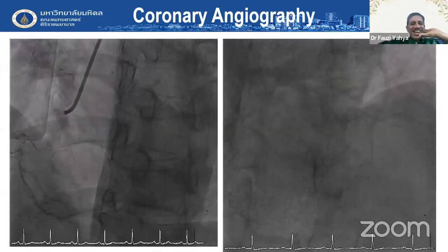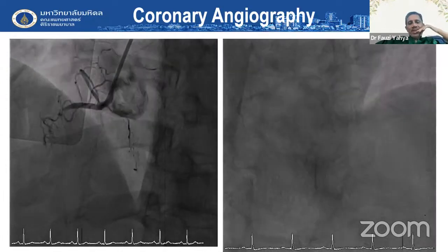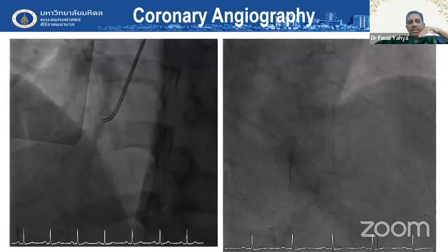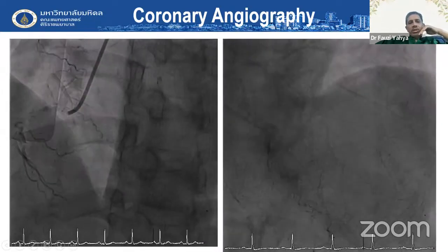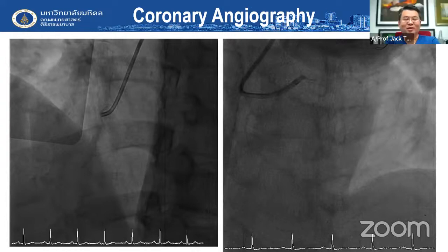Yeah, of course, I fully support revascularizing such very nasty vessels. So in doing that, I would like to perform complete revasc. In this kind of strategy, it's better to fix the RCA first, and then the left main, which I don't think is quite complex. We can cross over from the LAD to the left main, and maybe need some kissing balloon to the circumflex. But the RCA is really more complex than the left main. So it needs some strategy, so I'm thinking to fix the RCA and then followed by performing left main PCI.